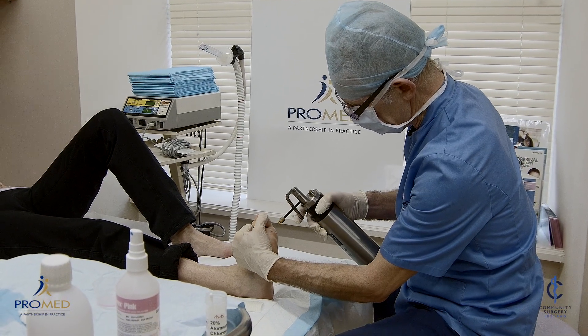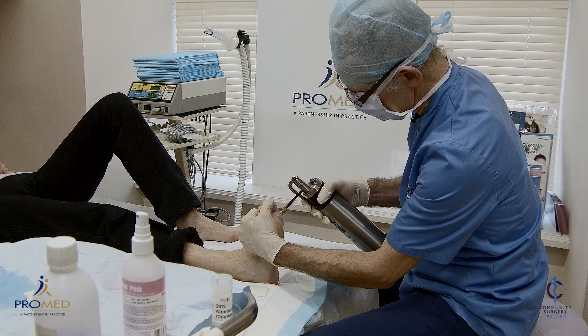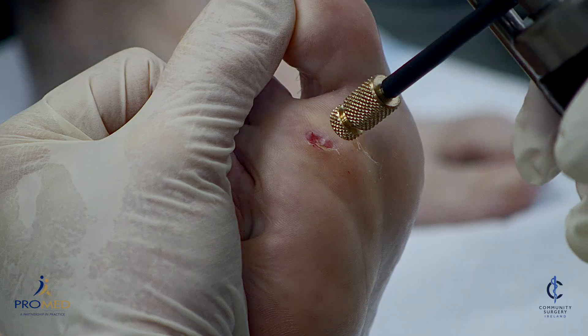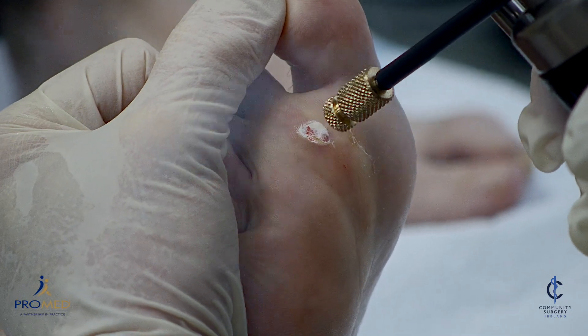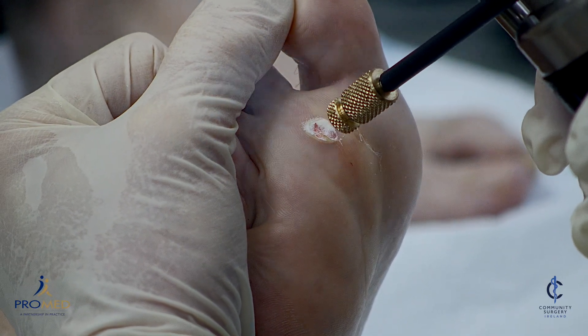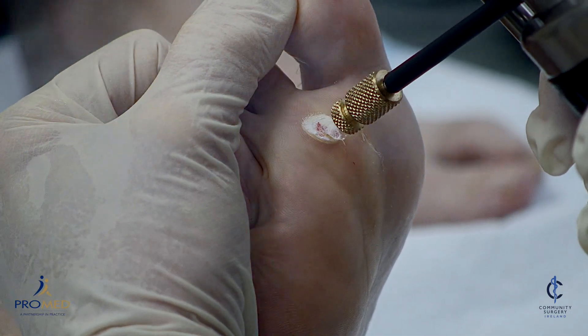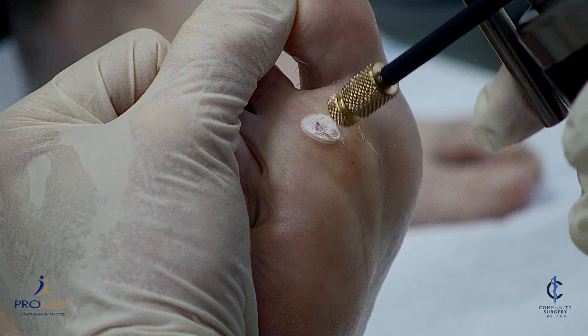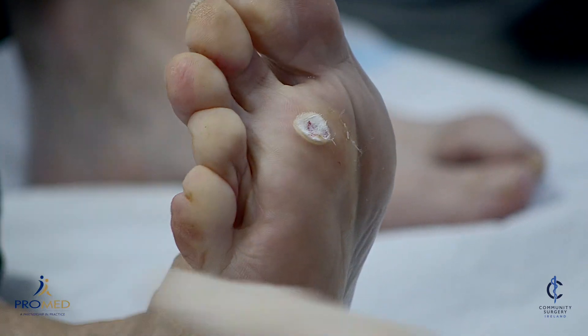You will be limping for about a week and then it should heal up in about two weeks. Same again now — keep freezing until it goes into ice. About two or three millimetres of clear skin is frozen and then we keep it at that for 10 seconds: 8, 7, 6, 5, 4, 3, 2, 1. Was that sore? No. Okay.